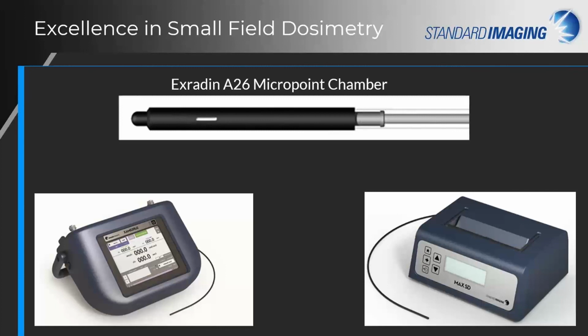To measure the smallest of small fields, we offer the first generation scintillator W1 with a 1 by 3 millimeter fiber. And as a dual channel detector, it is used in combination with our best-in-class Supermax electrometer. Or better yet, the latest scintillator, the W2, has a 1 by 1 millimeter fiber and is used in combination with the Max SD for water scanning. Both scintillators have a KQ of 1, making them ideal for stereotactic QA.